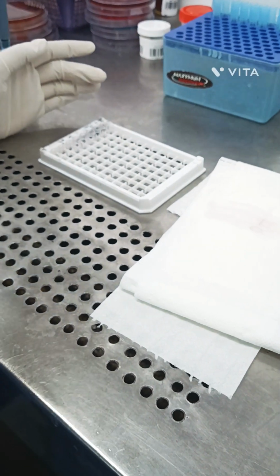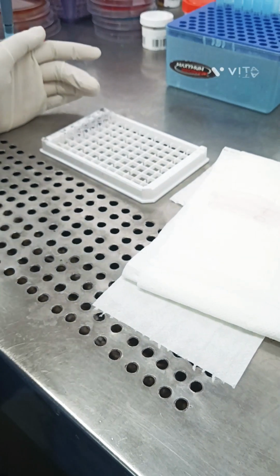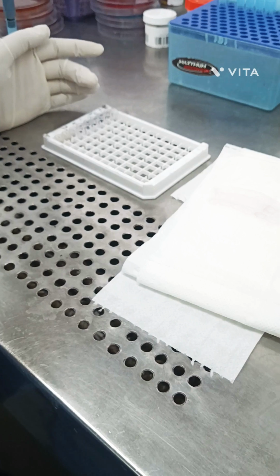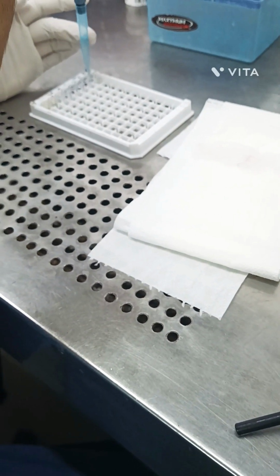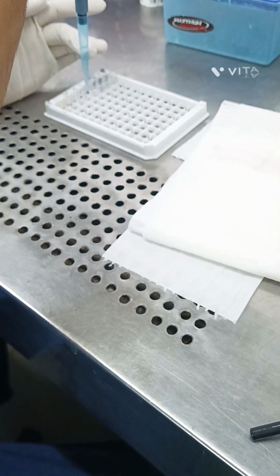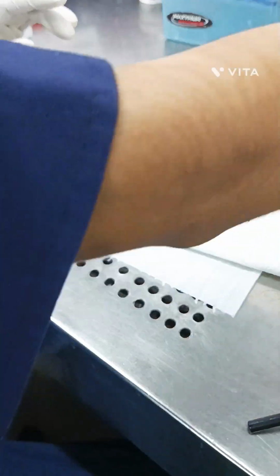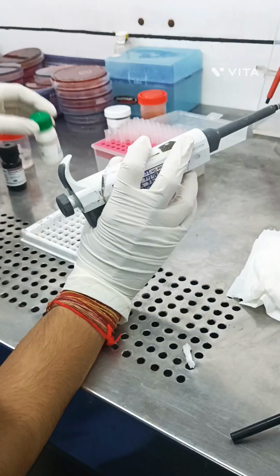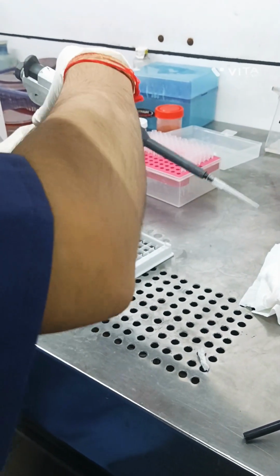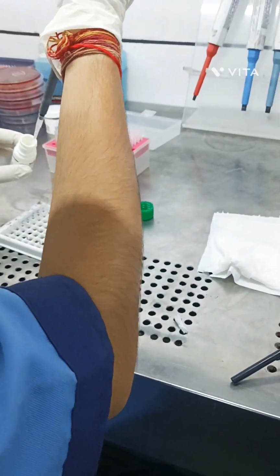So blot first, then wash 5 cycles with wash buffer. After 5 cycles of washing is done, add 50 microliter A and 50 microliter B substrate.